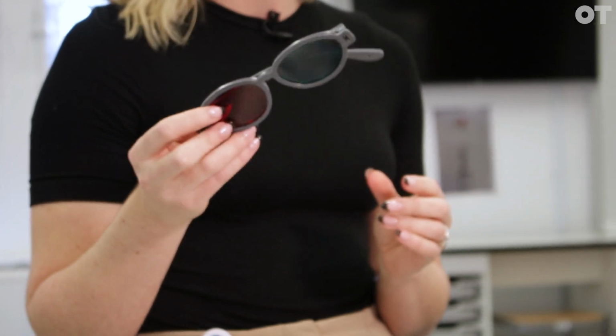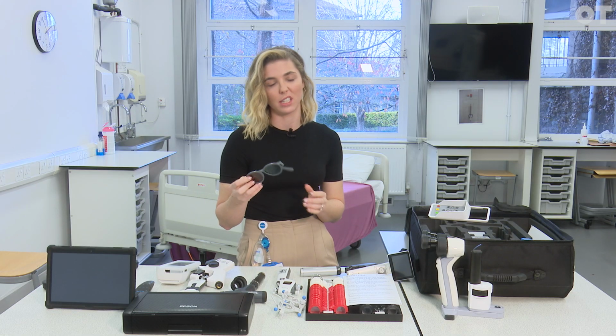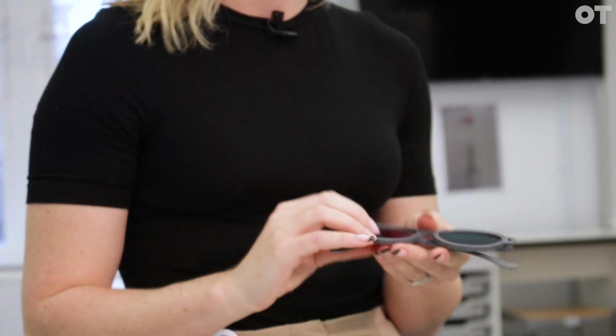Red and green goggles we also have, we can use those for fixation disparity. Any sort of binocular thing that we're wanting to check, we can use those for.